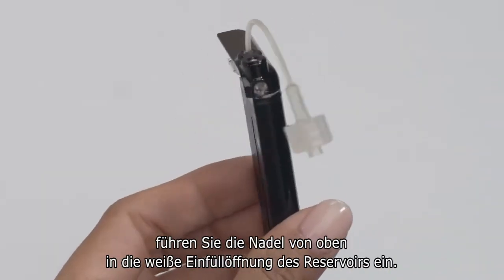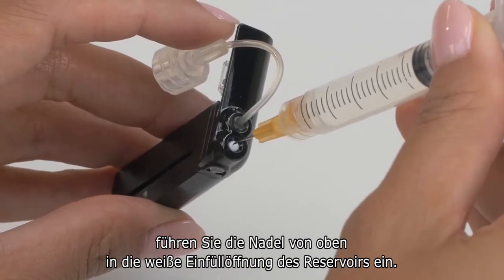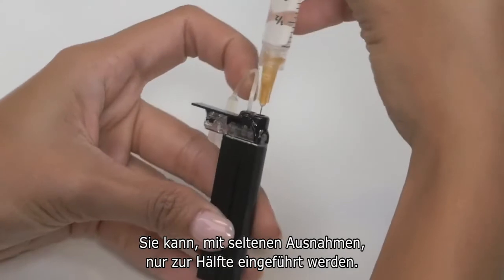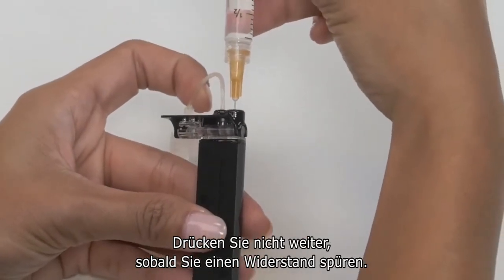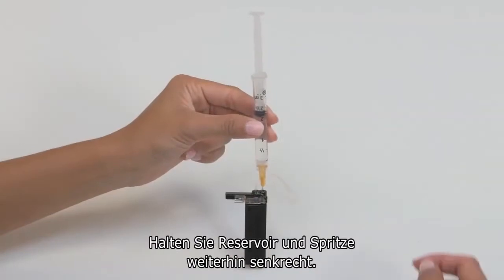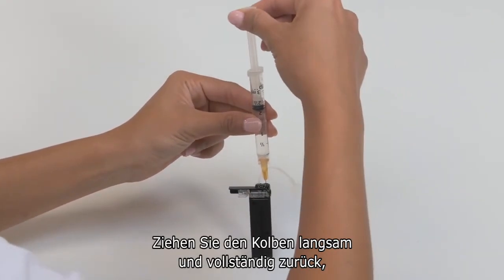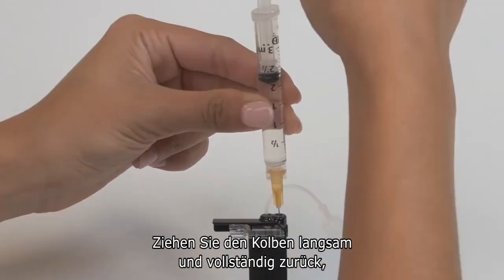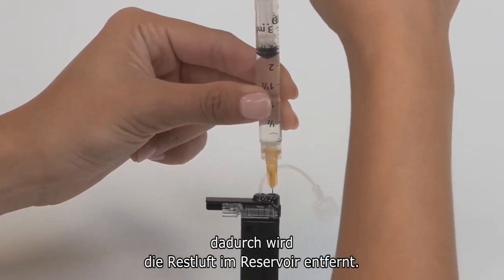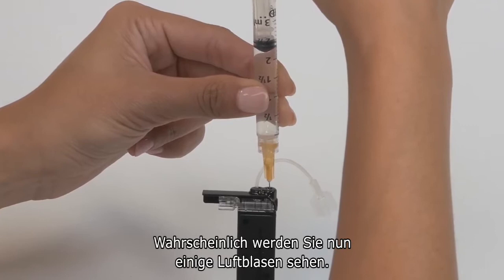Holding your cartridge upright, insert the needle into the white fill port on top of the cartridge. It should stop about halfway but occasionally will go all the way in — either way is fine, but don't try to force it. Once you feel some resistance, keeping your cartridge and syringe both vertical, slowly pull up on the plunger until it's fully retracted in order to remove any residual air in the cartridge. You'll probably see some bubbles during this step.